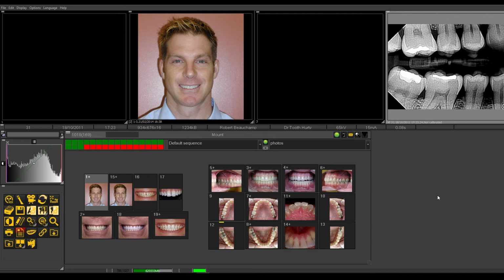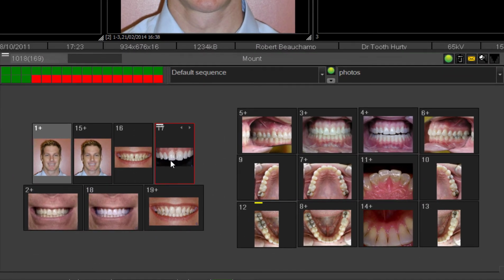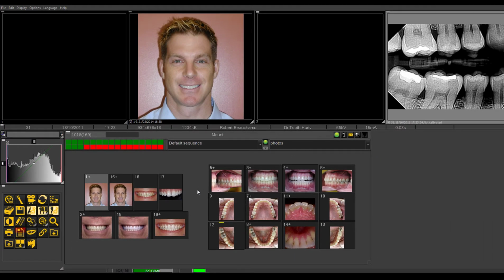Training on the imaging today, we'll be covering the use of an SLR camera in the dental office. Ultimately, it is an amazing tool to utilize in respect to getting full face pictures such as this. Great for cosmetic simulations and whitening simulations, and really the best image quality you can get through an SLR handheld camera.